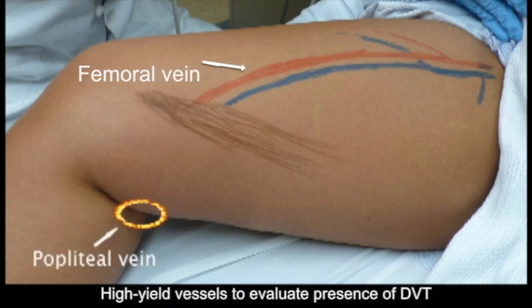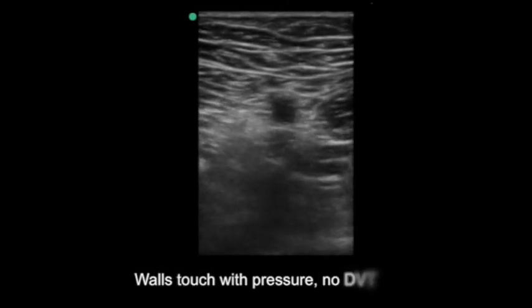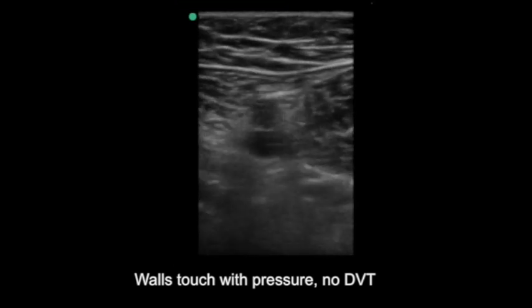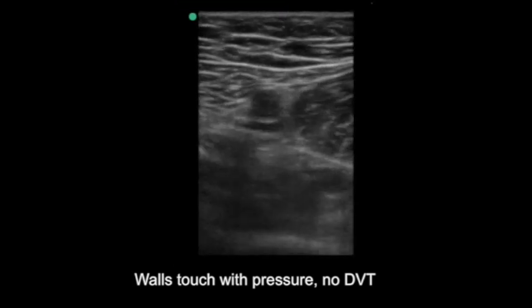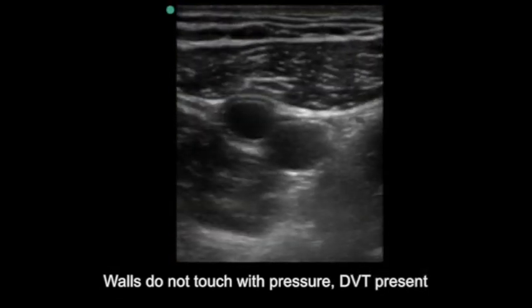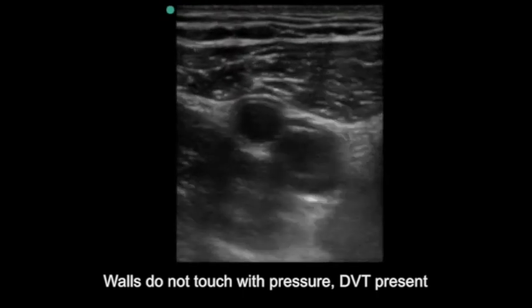Finally, we image the deep veins of the lower extremities. Both the femoral and popliteal veins should be viewed. If no clot is present, the walls of the veins should touch with transducer pressure. If clot is present, the walls of the veins will not touch, even when enough pressure to compress the artery is applied.